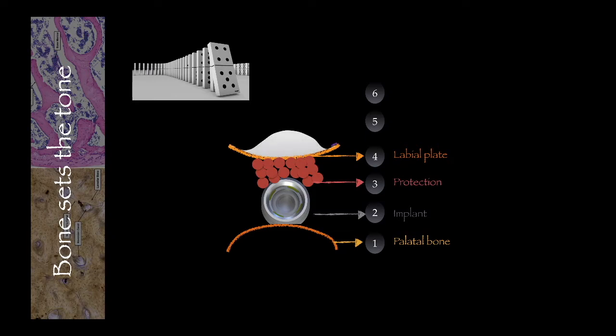And then we need to achieve that convexity we were talking about. You could decide to go for some type of bone augmentation to ridge contour that area, or you might decide to use soft tissue graft to contour that area. It's up to you to decide what you want to do. But what I don't want you is to just ignore it and do nothing. And that's why I never go for flapless implants in the aesthetic region without any further bone or soft tissue management for that convexity. You could go flapless and could do tunnel technique and put connective tissue graft if this is what you want to do, fair enough.